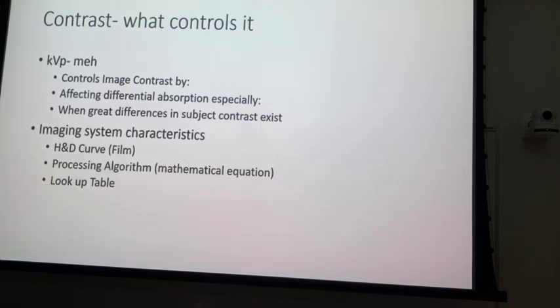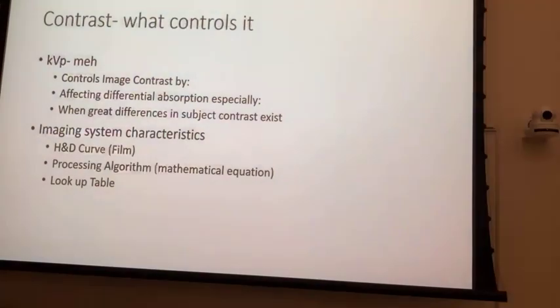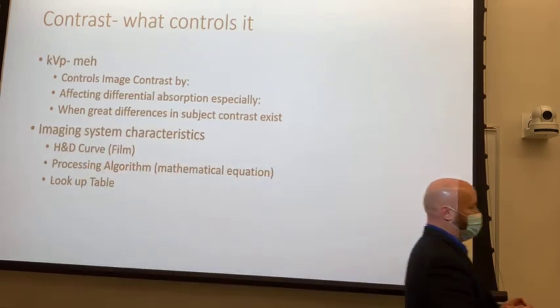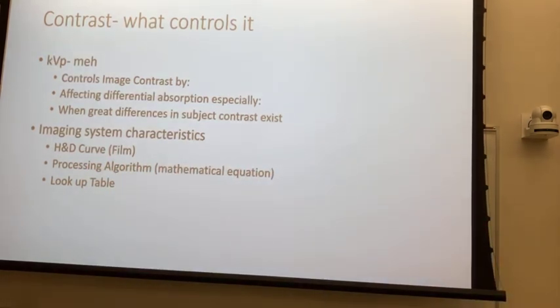What I mean by that is, if we have a lookup table that's supposed to be representative of high contrast film, then we apply an image of an H&D curve that should represent that particular set of contrasts.